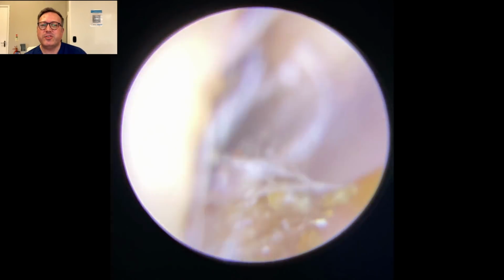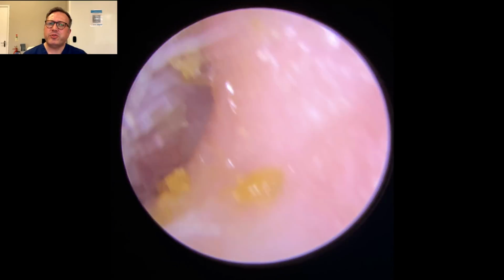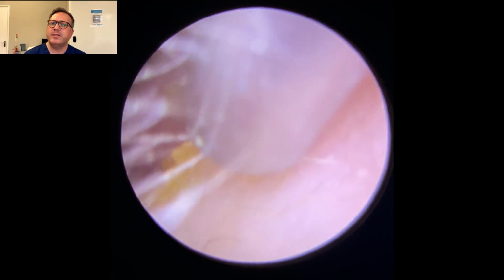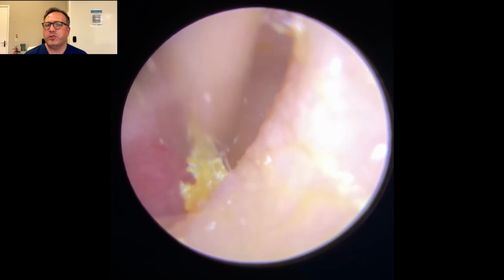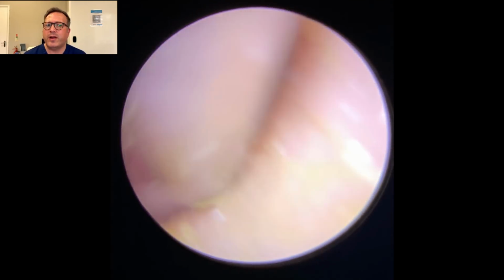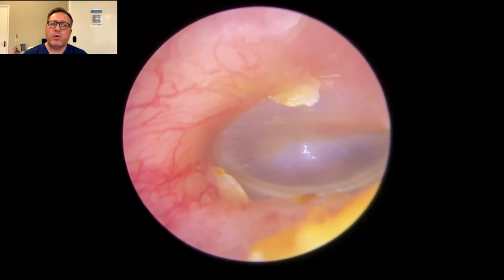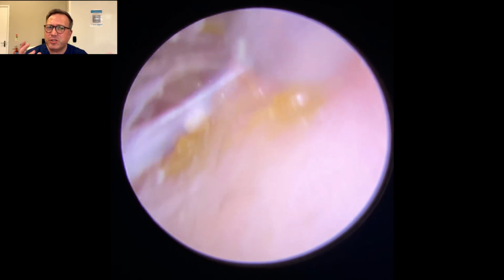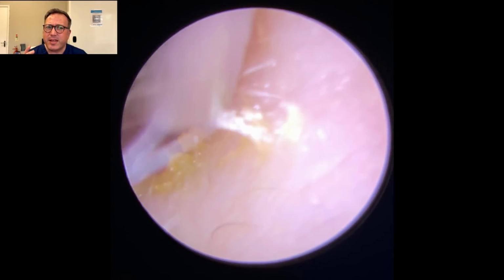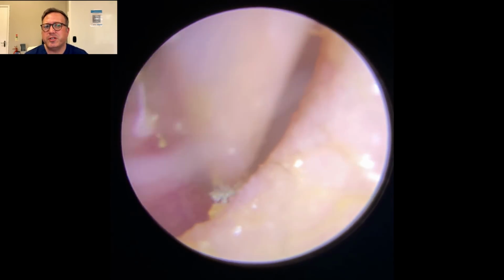So you can see now we're just taking away some of the looser bits of debris that got left behind. It's quite an interesting video, this one, because the patient has treated the wax very differently in both sides. On this side you can see that olive oil's gone in, softened that, prepared for the wax removal. The patient didn't realize that they had wax on the other side, so they haven't really prepared that side at all. It's a good way for you to see the difference between the preparations in both sides, which is why we said it was treated and untreated here.